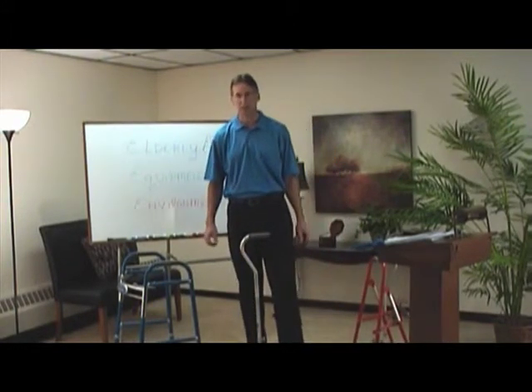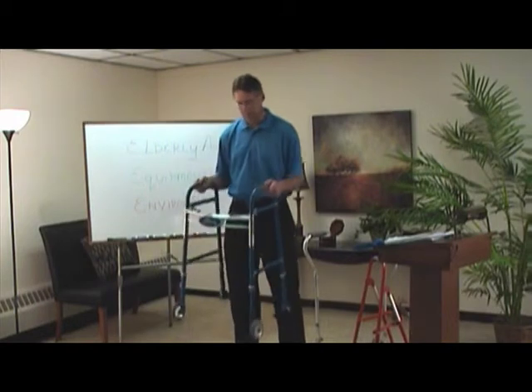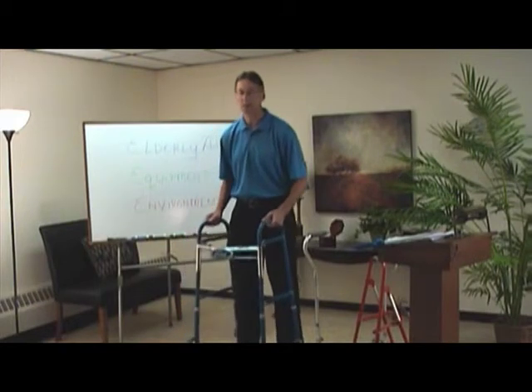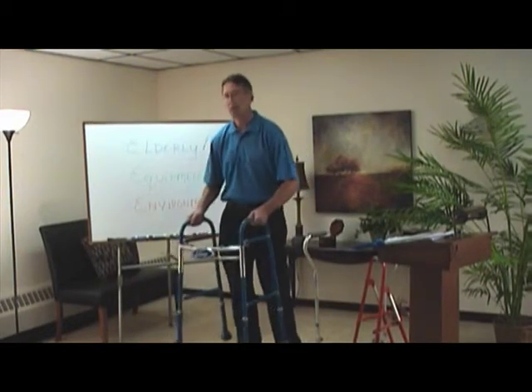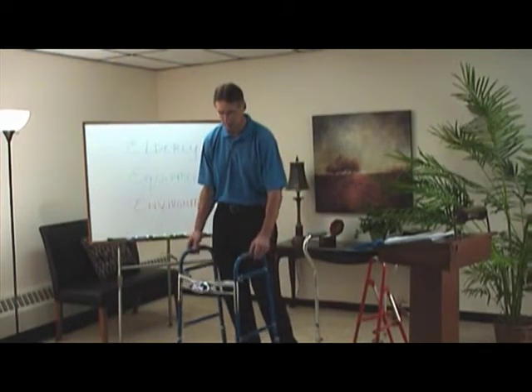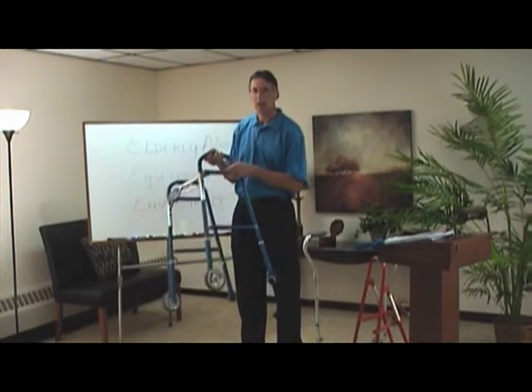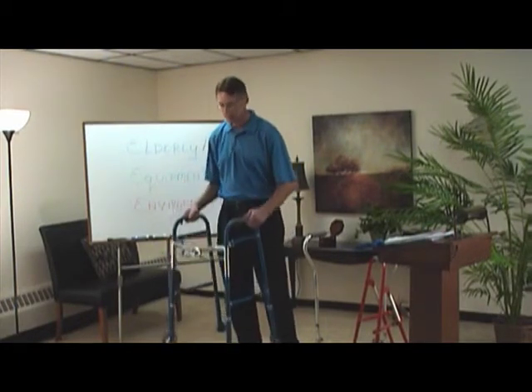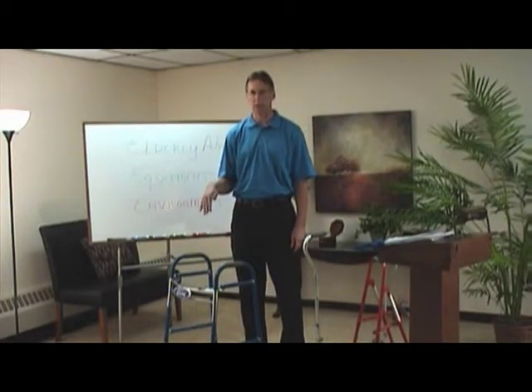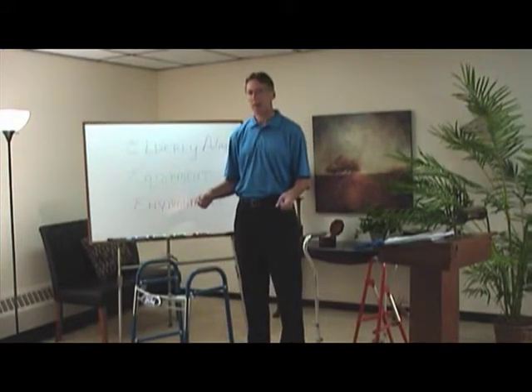Just a couple of quick differences between some of the devices here. Quite often people use a regular walker, which has no wheels, but of course you have to pick it up, and that actually does, to me, put you at a little risk, because every time you pick it up you could lose your balance and fall. So I do prefer walkers with wheels. The walker with front wheels and maybe tennis balls or gliders on the back is more stable than the walkers with 4 wheels. But unfortunately the tennis balls wear out fairly quickly, and even the gliders get worn down fairly fast.